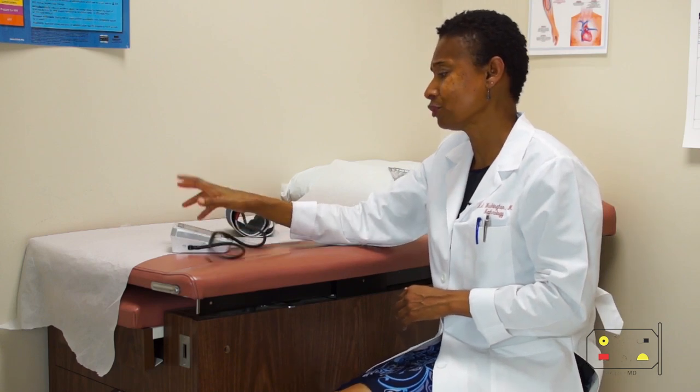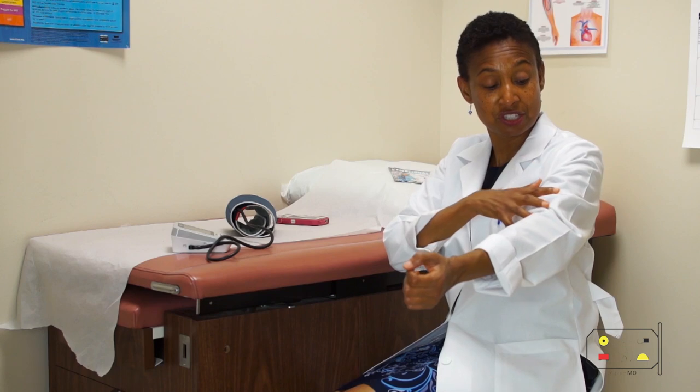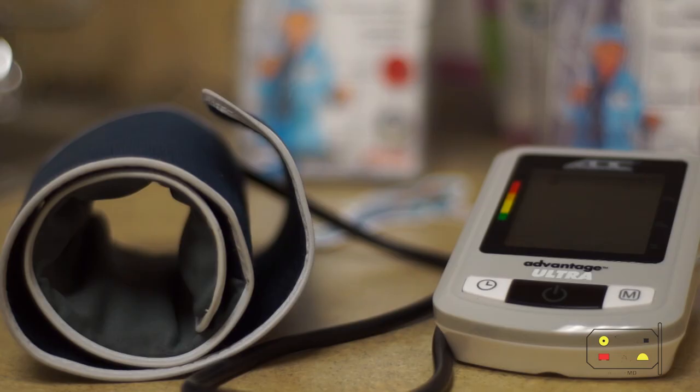Now there's various blood pressure monitors out there. The one that I like to use the most and recommend for my patients is the digital blood pressure monitor. Not the one for your wrist, but the one for your arm, your brachial artery. Why? Because this is the artery that is closest to your heart. The whole idea of measuring your blood pressure is that we see what the heart sees. So you want a blood pressure monitor that is to your brachial artery, the name of the artery in your arm, at table level close to your heart.